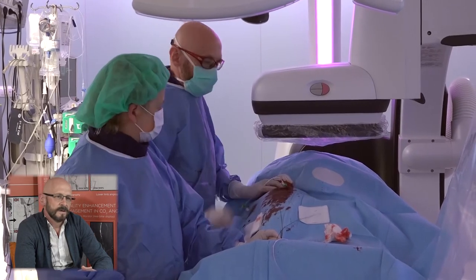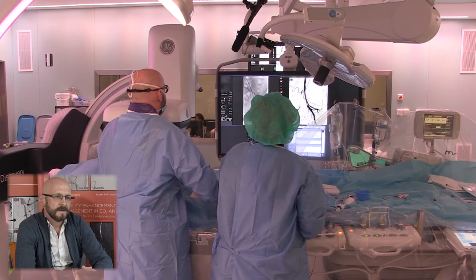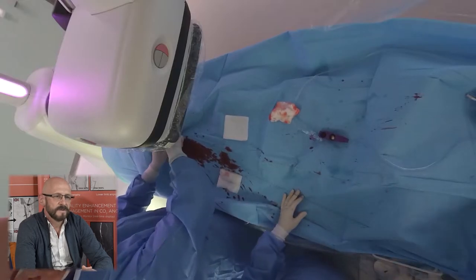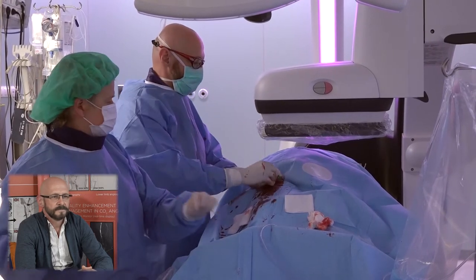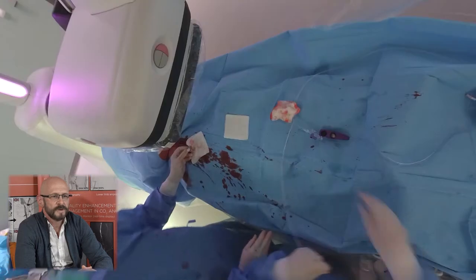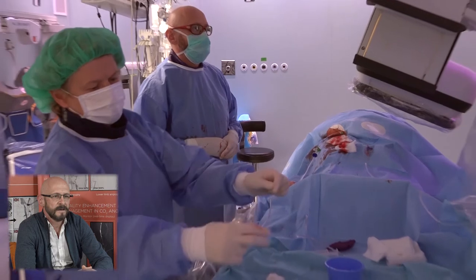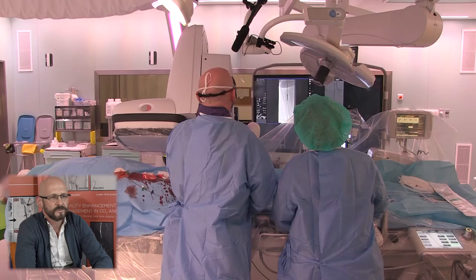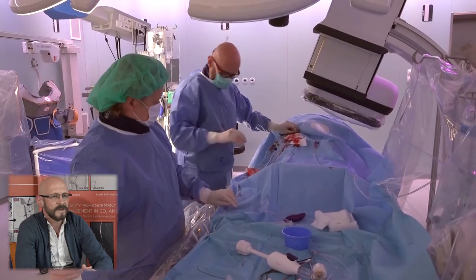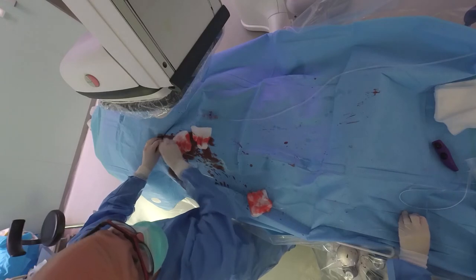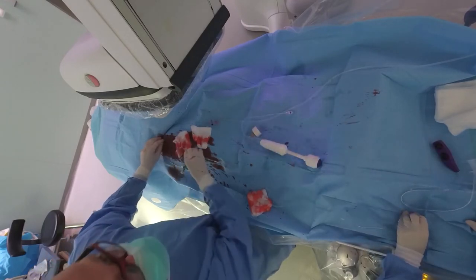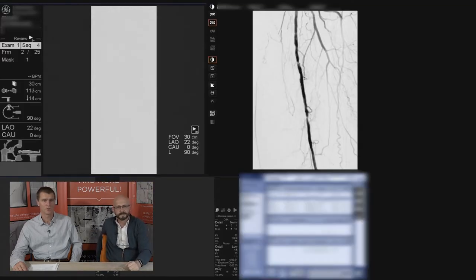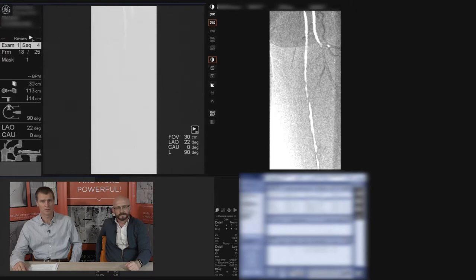As you can see, the patient is obese. One of the problems with these patients is that you need a higher amount of contrast material with increased radiation, and sometimes the image quality is far from optimal. Not to mention if you have to use oblique rotation — in this case a left oblique rotation just to identify the deep femoral and superficial femoral artery and find the appropriate angle to see the proximal part of the SFA. Every time you see the big screen on the left side, you see the DSA generated by GE, and on the right side you see the DVA image generated by the Kinepict software.